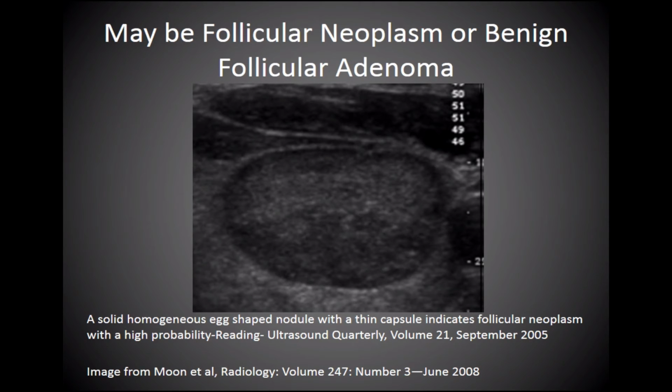Also, if you look at the interior architecture of the lesion, you will see what appears to be microcalcifications, which again leads one to believe that this might be neoplastic. If you do an FNA of these lesions, I am told from a pathology perspective that it is difficult to make the diagnosis by FNA, and FNA can only provide a diagnosis in 20% of the cases. Therefore, in this lesion, it's probably best to do a biopsy or an excision.